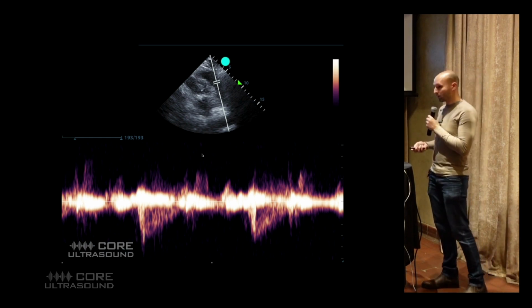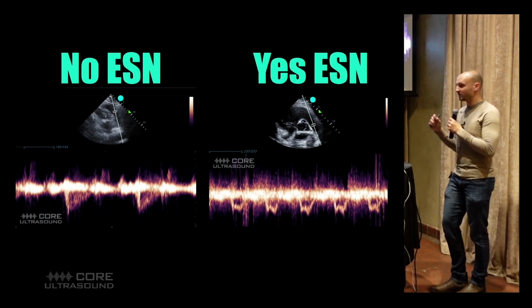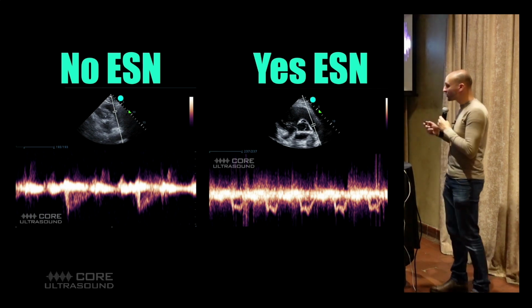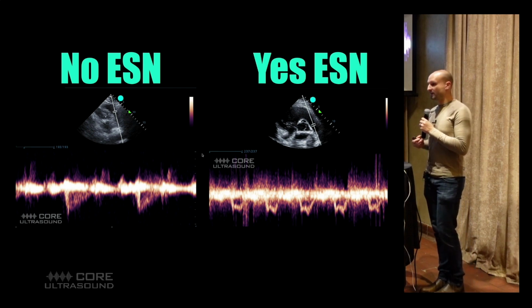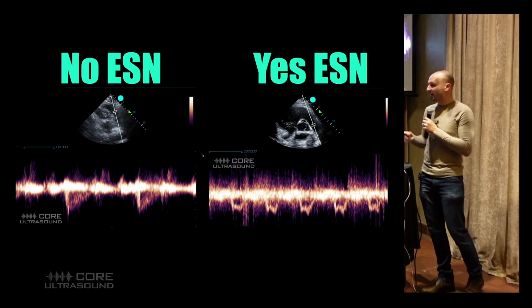This is normal. This right here is early systolic notching. So you see a notch, and the early systolic notching by definition is in the first 50% of all of systole for that pulmonic valve. So if you see it in the first half, which we're seeing here, this little notch right there, little notch right there, little notch right there, that should increase your suspicion that the patient's process today is an acute right heart process rather than a chronic right heart process. No calculations, just is that notch in the first half or not?